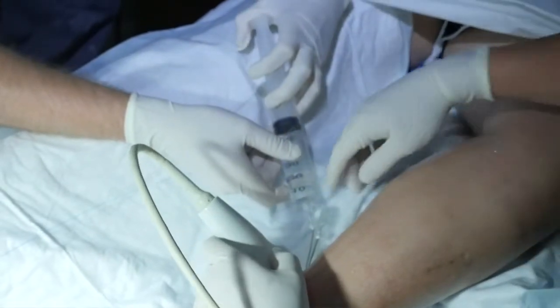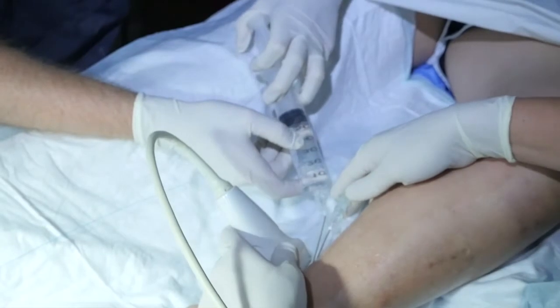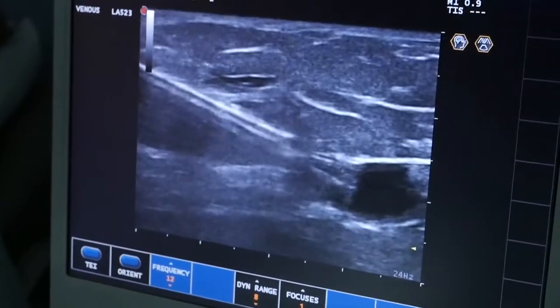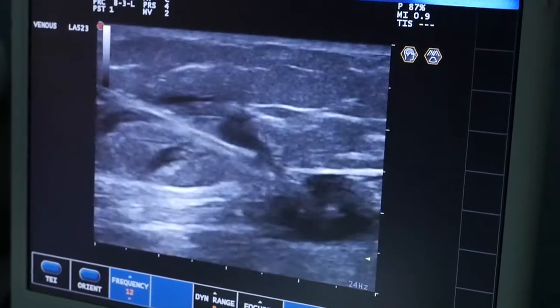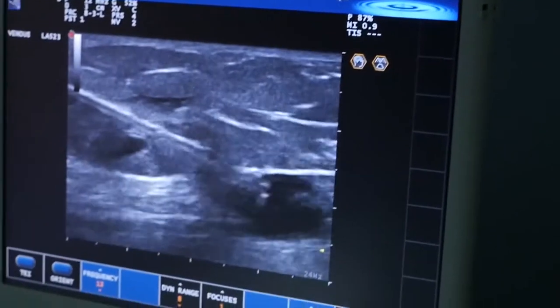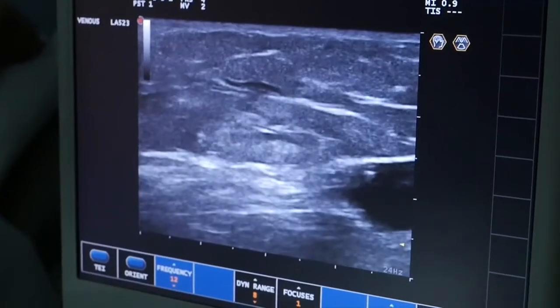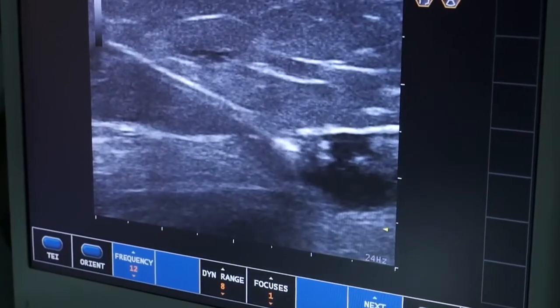So now we've positioned our needle tip and laser fiber at the fascial defect, and we're placing another spinal needle alongside our perforator fiber and injecting tumescent anesthesia around the perforator. So we'll make sure that there's adequate tumescent anesthesia, to prevent possible neuropathy from any nerves being around the perforator, and also to make sure that the patient tolerates the procedure.